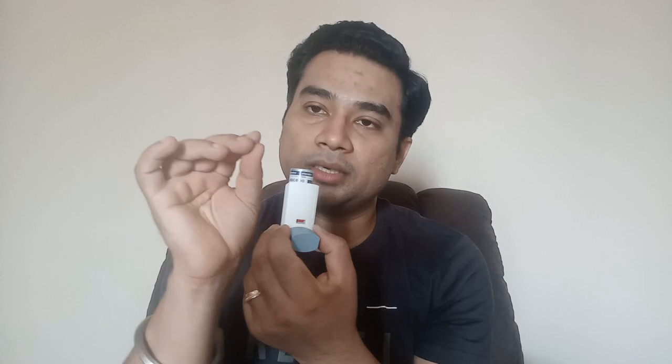Okay. Now this inhaler can be of different types. Various inhalers are available in the market. This inhaler is basically a metered dose inhaler with manual dose counting here. In the market we also get inhalers which have digital dosing. Here it is manually done. It moves 20 or 40 markings at one time. But in digital you can have an accurate measurement of each dose. After each dose there is a decrease of one. So this depends upon the type of inhaler that has been prescribed by your physician. Nothing to worry about this.